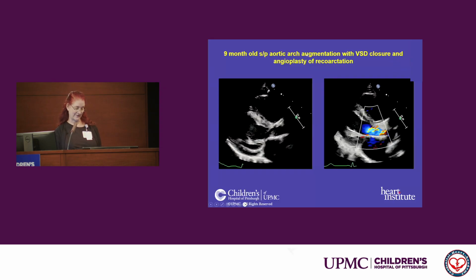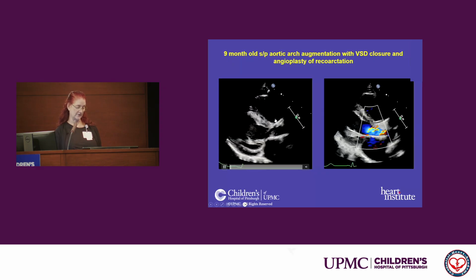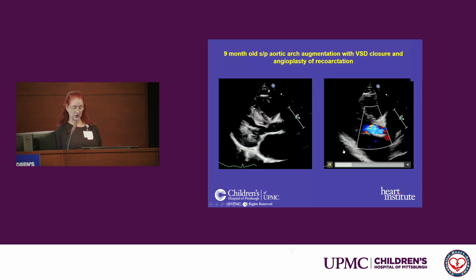And then at 9 months of age, this child got another follow-up echo, and now the LV outflow tract is looking very abnormal. It's hard to tell on this. You can see there's an aortic valve here. You get a hint of some muscle going in and out, and there's also a tiny membrane. We look with color. The color can help you because the AI here is coming from the aortic valve annulus, so I know the annulus is here. So this is subaortic stenosis, and the sinotubular ridge does not look very large in this picture either.